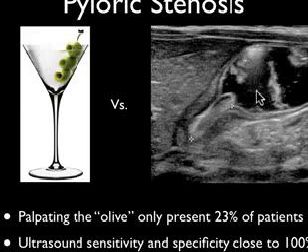The stomach will be squeezing, but it can't get the fluid through this stenotic pylorus. Some of the limitations here: if the patient's crying, you have to do this between the cries. As the patient goes, wah, you can't really do it then, but between the cries, when they go to take a breath, everything relaxes, and that's when you can get in and get a good view. So sometimes you only get the view between the cries.